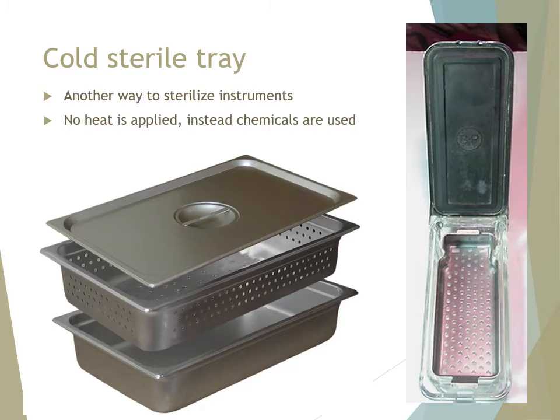Now we're going to look at the cold sterile tray. So this is another way to sterilize, and we just use chemicals. Now one of the things that typically we use this for is for sharps, no, yung mga scissors, scalpels, and our needles, because the heat destroys the edge. So this one preserves it, but it is also, syempre, tedious, no? So I'm not going to ask you to identify the chemicals, but needless to say, we do have chemicals that can be used to sterilize and kill bacteria.